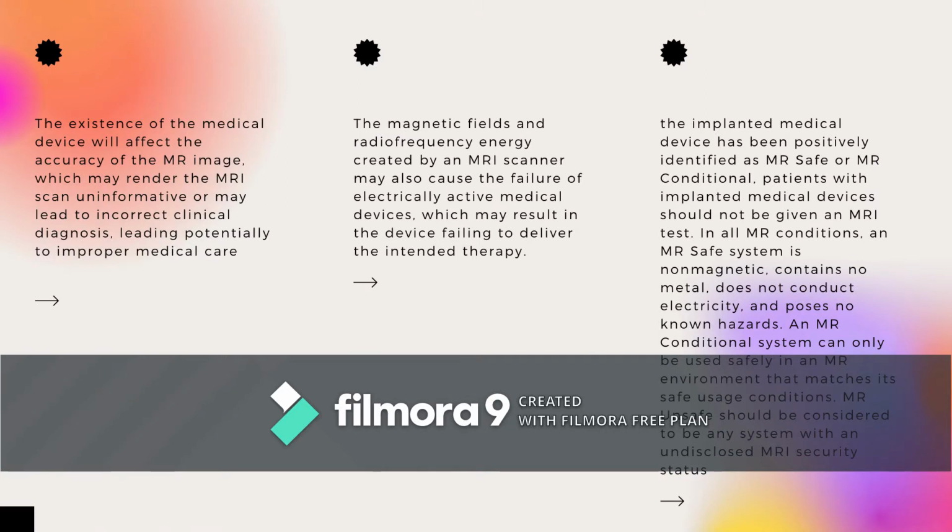The existence of the medical device will affect the accuracy of the MR image, which may render the MRI scan uninformative or may lead to incorrect clinical diagnosis, leading potentially to improper medical care. The magnetic fields and radio frequency energy created by an MRI scanner may also cause the failure of electrically active medical devices, which may result in the device failing to deliver the intended therapy.